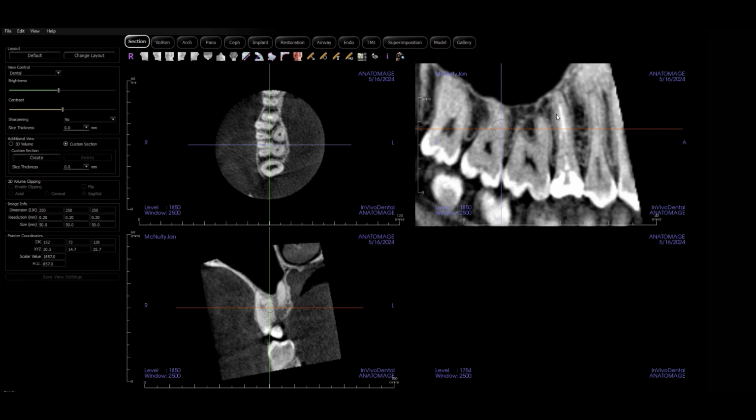Sometimes that is the only way we're going to do it, in great part because it's harder to pre-curve nickel titanium rotary files. With that said, the new version of nickel titanium files are better because they can be pre-curved. They don't have memory, so not having memory with NiTi is advantageous. Having memory means it's more likely to stay straight. You're more likely to get transportation of the canal.